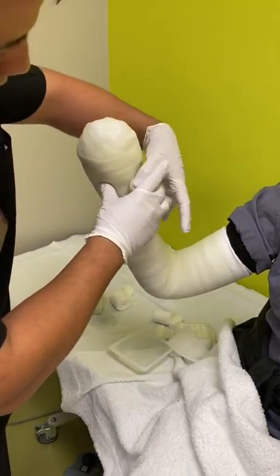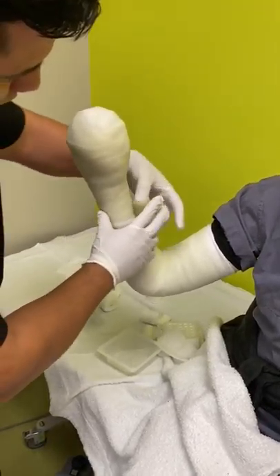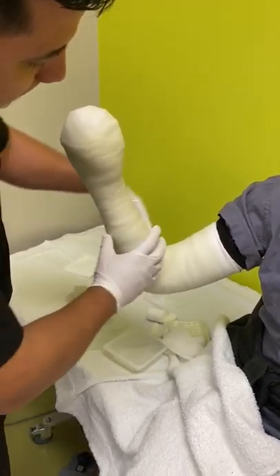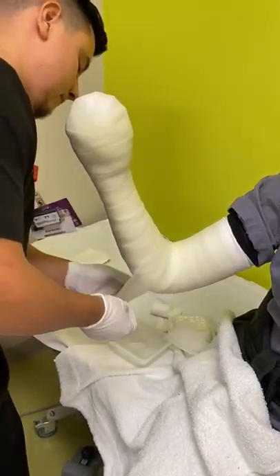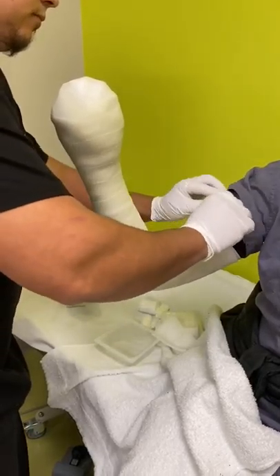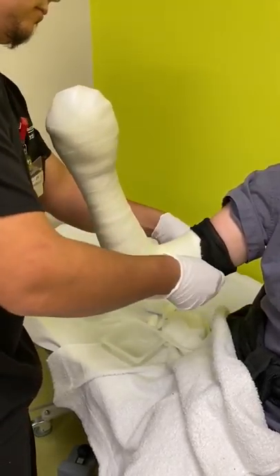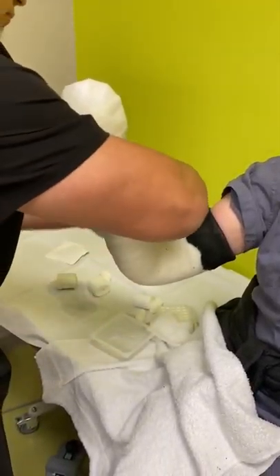Nailbed lacerations on three- or four-year-old patients are another good option for a mitten cast, until they're able to follow up with an ortho or hand specialist. It just keeps the injury site closed and inaccessible to the patient.